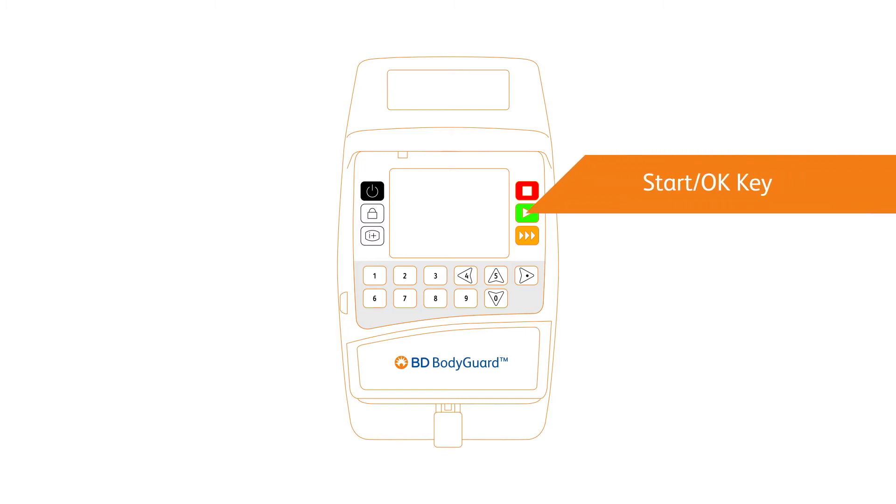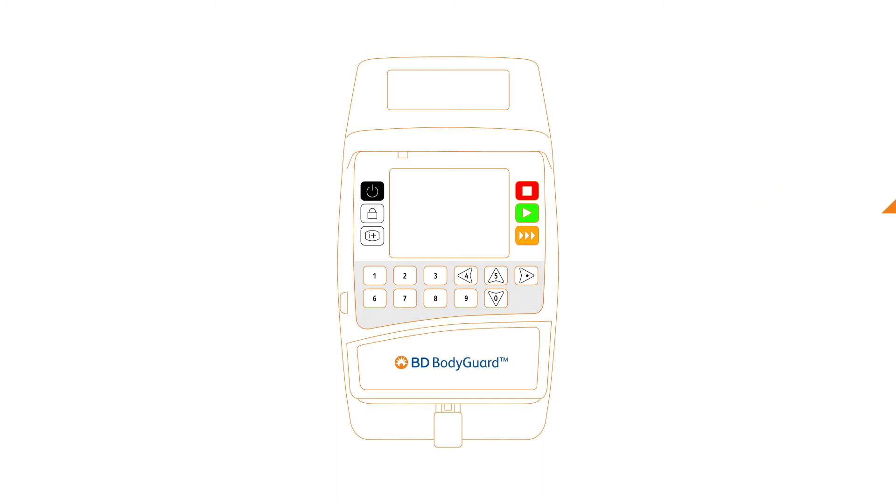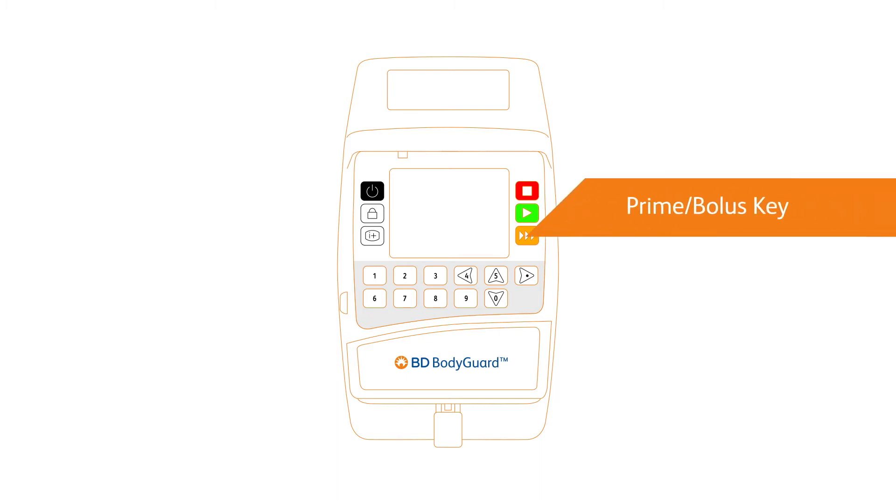The green start key confirms selections and settings and starts infusion. The orange prime/bolus key primes the infusion set during programming. During continuous and PCA infusions, this key delivers bolus or secondary infusion.